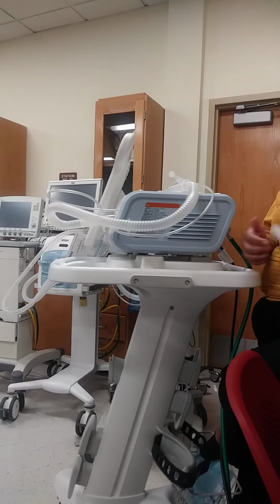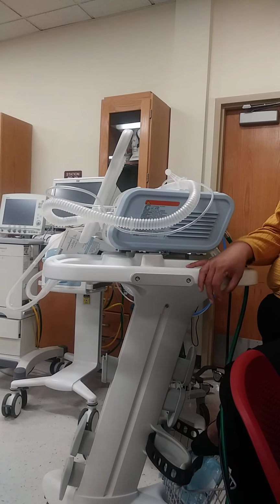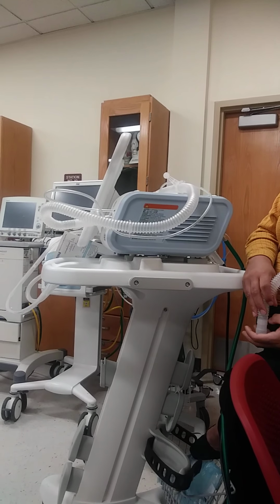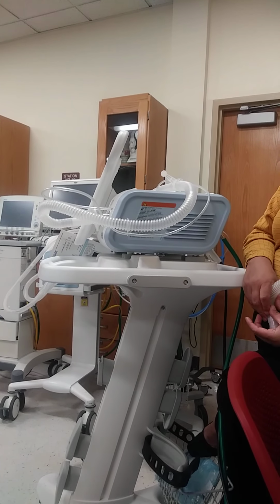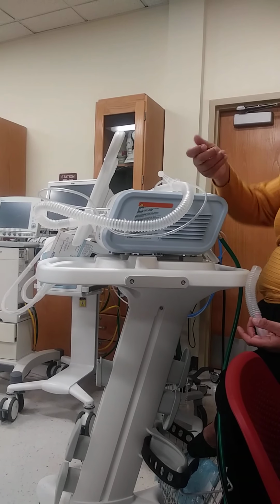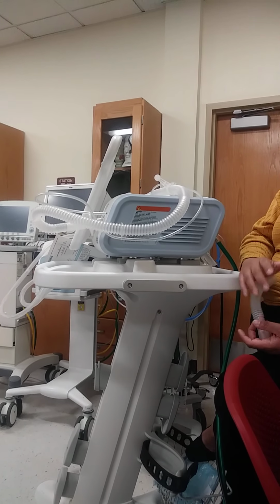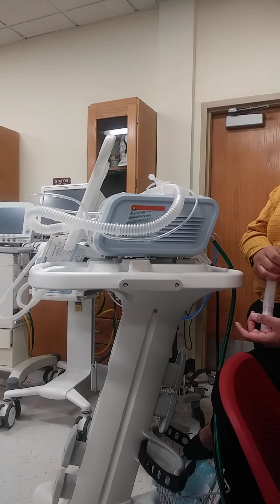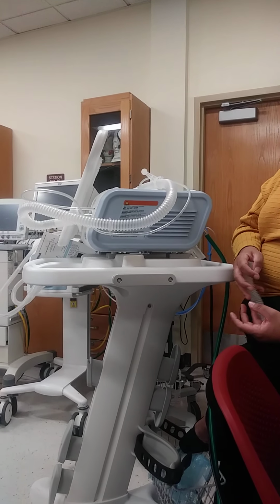Very common for major upper thoracic and abdomen surgeries. If they're high risk, we would either leave them on the ventilator or pull the tube and put them on this while they get better, while they wake up, while their pain is more controlled.